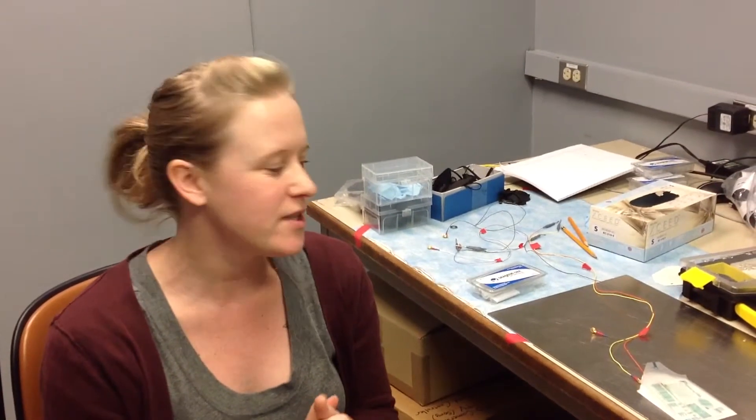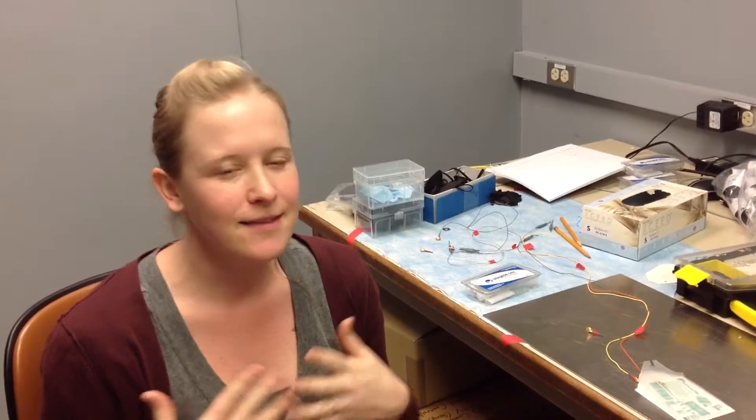Before we demonstrate the ERG, I wanted to tell you a little bit about the electrode itself that we use to pick up the signals from the eye. That's the part that people tend to get a little bit squeamish about, so we just want to show you that it's really no big deal. It's understandable — people don't like things touching their eye, it sounds a little bit weird, but this is a totally standard way that this is done and it's not painful at all.